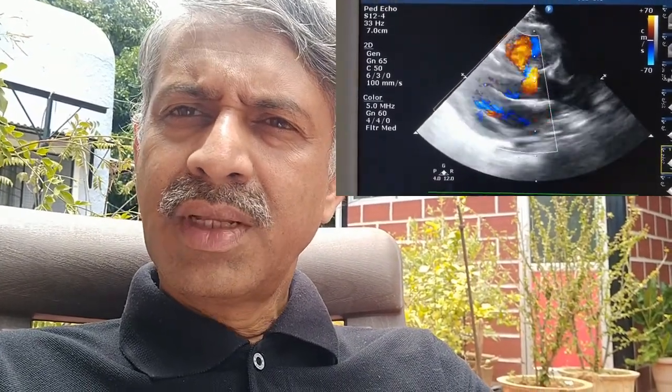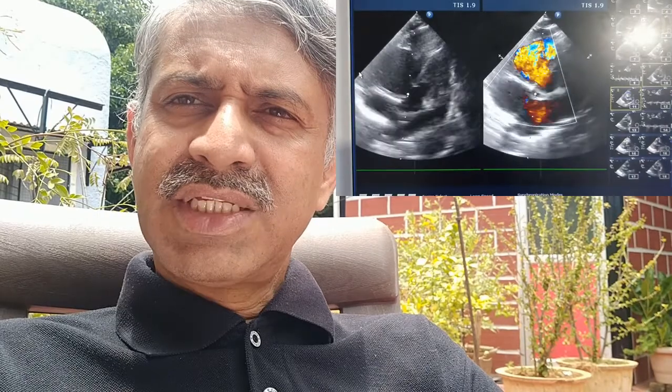Echocardiography was performed, which demonstrated a ventricular septal defect, subpulmonic, measuring around 7.5 mm. The shunt across the ventricular septal defect was left to right. There was good flow across the pulmonary valve.